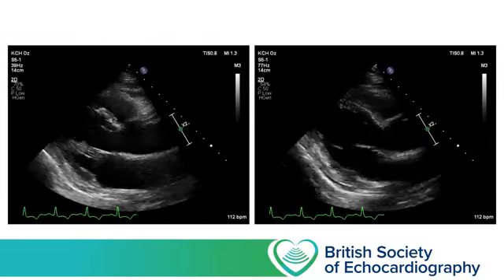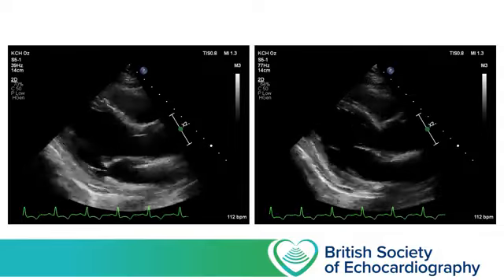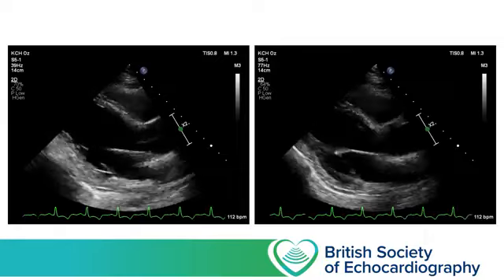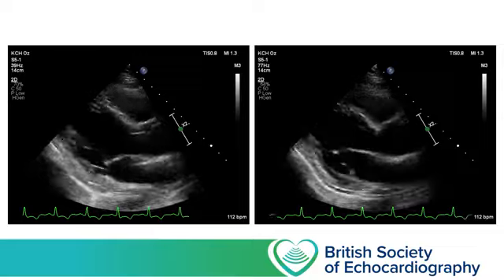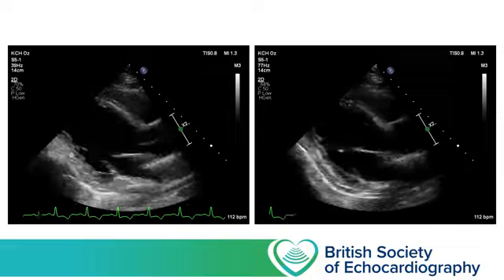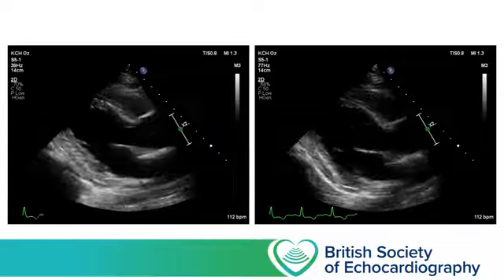Okay, so as I mentioned earlier on, some ultrasound systems, especially higher end systems, will allow you to specify whether you'd like an image that favours frame rate or favours lateral resolution. So here you can see two images side by side, both parasternal long axis of the same patient. The image on the left is produced using an increased line density, and the frame rate is just 39 frames per second. For the image on the right, we've asked the ultrasound software to favour temporal resolution, increase the frame rate, but it's done this at the expense of reducing the number of lines. There's no single correct way of setting up your system here, and the decisions you make about trading line density and frame rate will be dictated by what it is that you're trying to demonstrate.